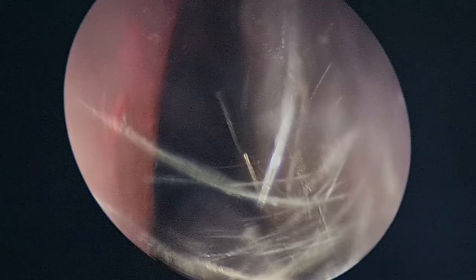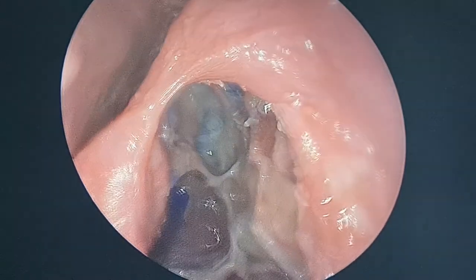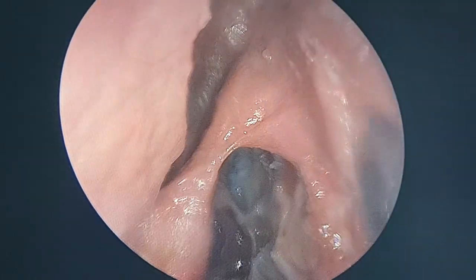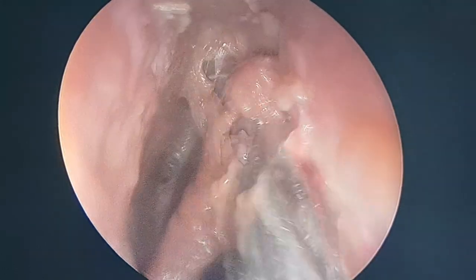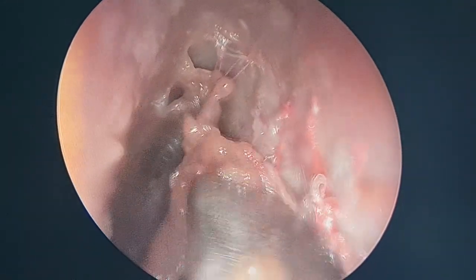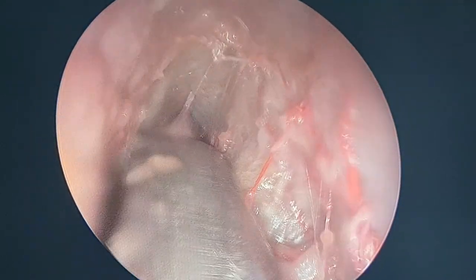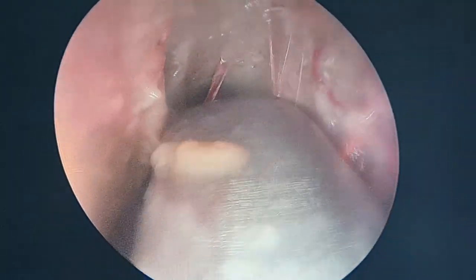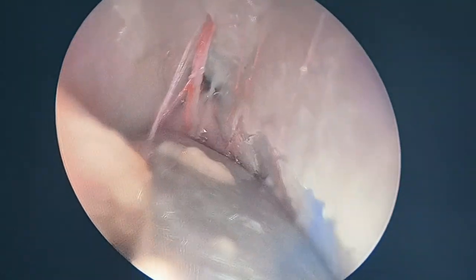Draf procedures are intended to deal with the frontal sinus, here with a 0 degree. What we need to do is, what is the obstacle? This beak. So in Draf, in live surgery, you can use your coblator and remove this mucosa. Simple. Or you can preserve this mucosa as a flap to line the raw area later, whatever. So here, for demonstration, I am removing this mucosa. See this? I am with a 0 degree now. See, what is this? Not the olfactory fiber. That's the anterior ethmoidal artery going above. This is not the first olfactory fiber.